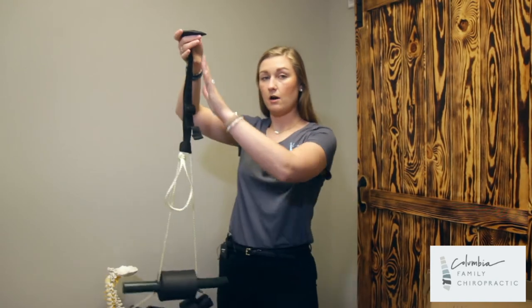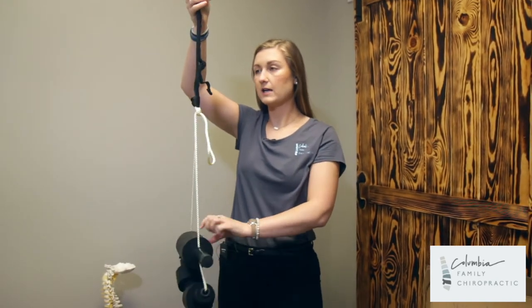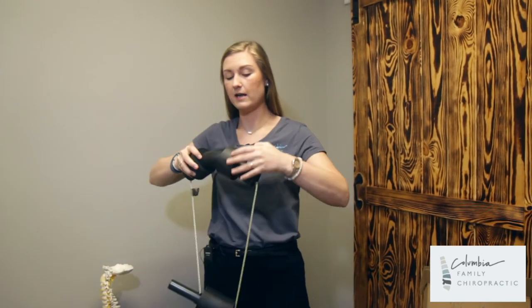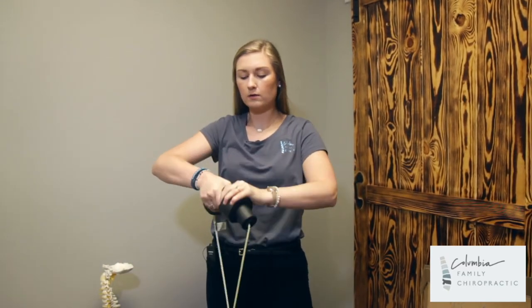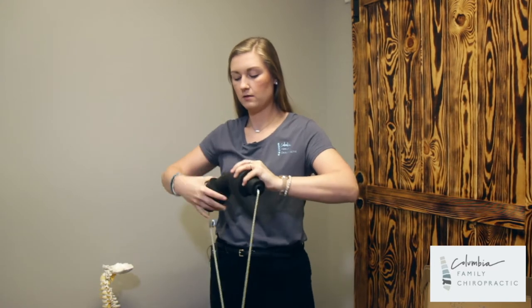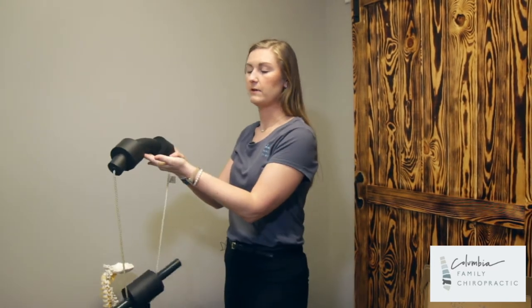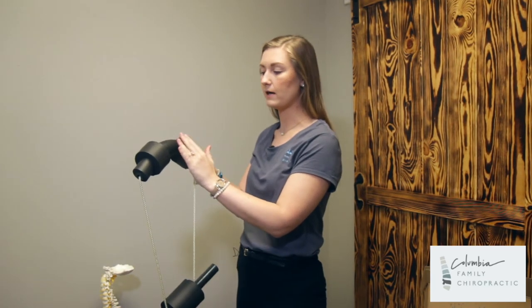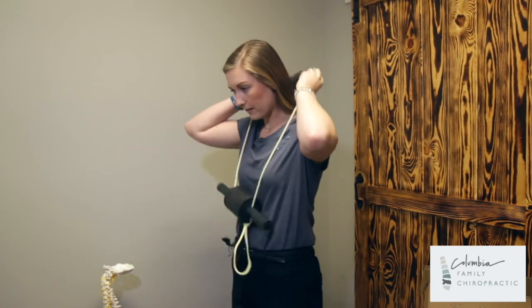Once you take this off the door — because that will be the other exercise you will have done — you are going to use it slightly differently. You will still put this behind your neck, and wiggle these out so that your neck is on the thin bar. This is what the thin position is: your neck being directly on this thin bar.